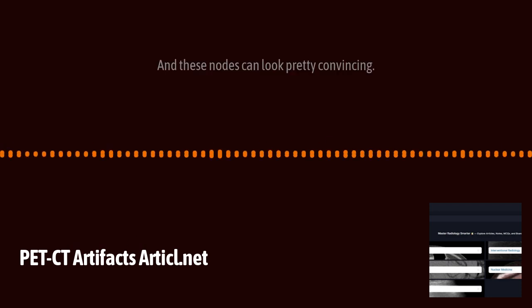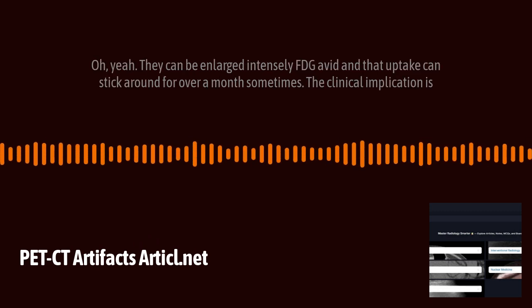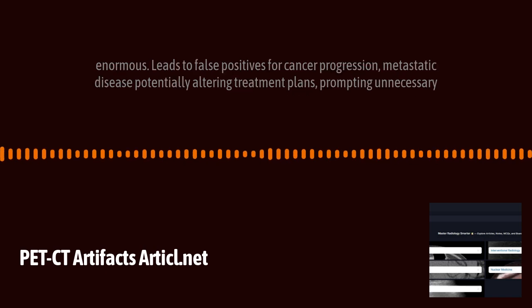And these nodes can look pretty convincing. Oh yeah, they can be enlarged, intensely FDG avid, and that uptake can stick around for over a month sometimes. Wow. The clinical implication is enormous.